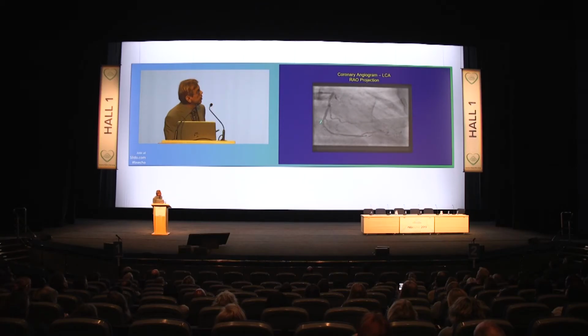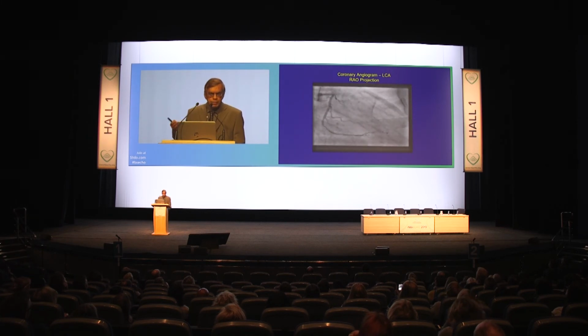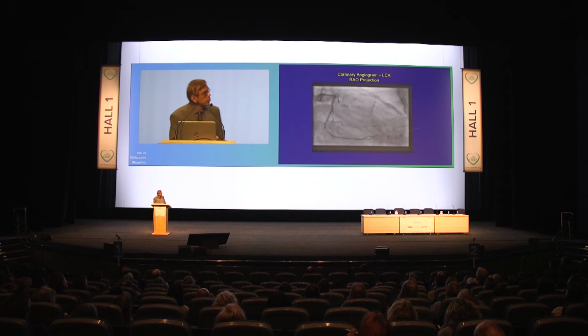So we rang Carlo and said, okay, this patient needs an angiogram, and the patient then flew into the cath lab instead of going back to Kuwait. And this is the angiogram: blocked LAD. Now you might say, well, there's a perfusion defect only at the apex, five segments, and it's a completely blocked LAD, but look at the collaterals here. This collateral is maintaining some of the perfusion, but the point is the patient has significant coronary artery disease.